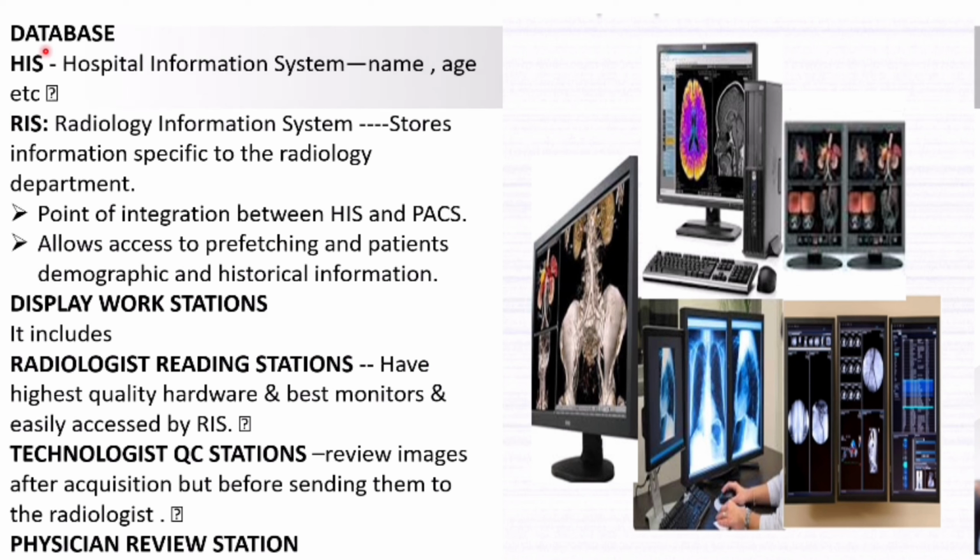Now is the database. We have HIS and we have RIS. HIS is the hospital information system, where we enter the patient name and assign one particular ID, age, etc. We have RIS.